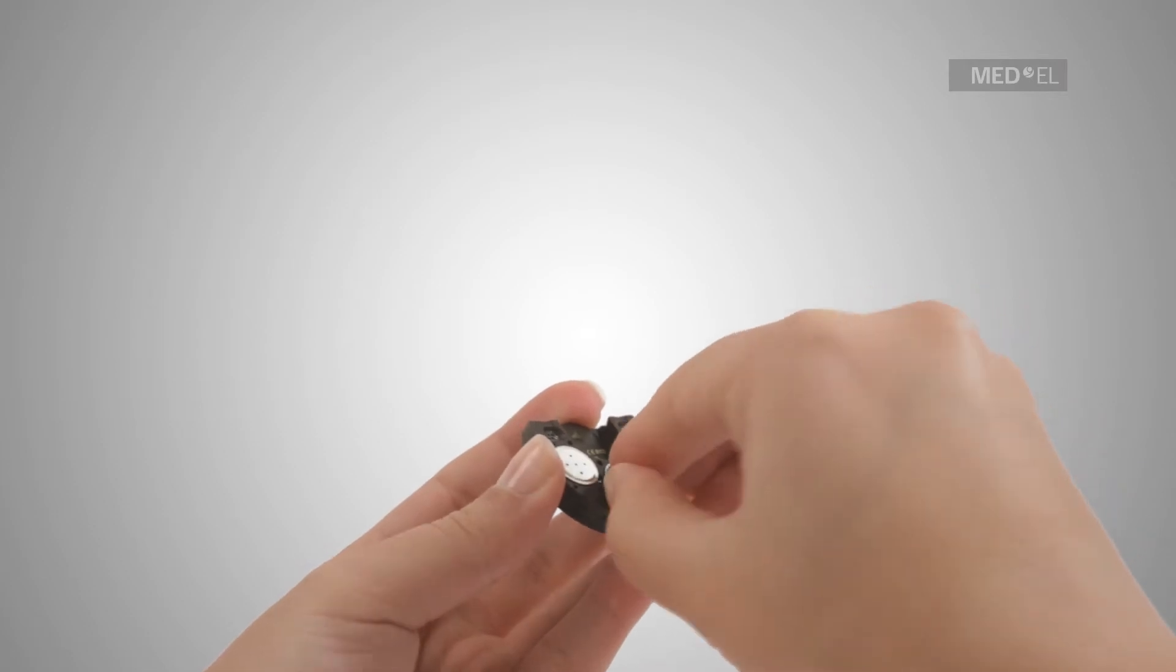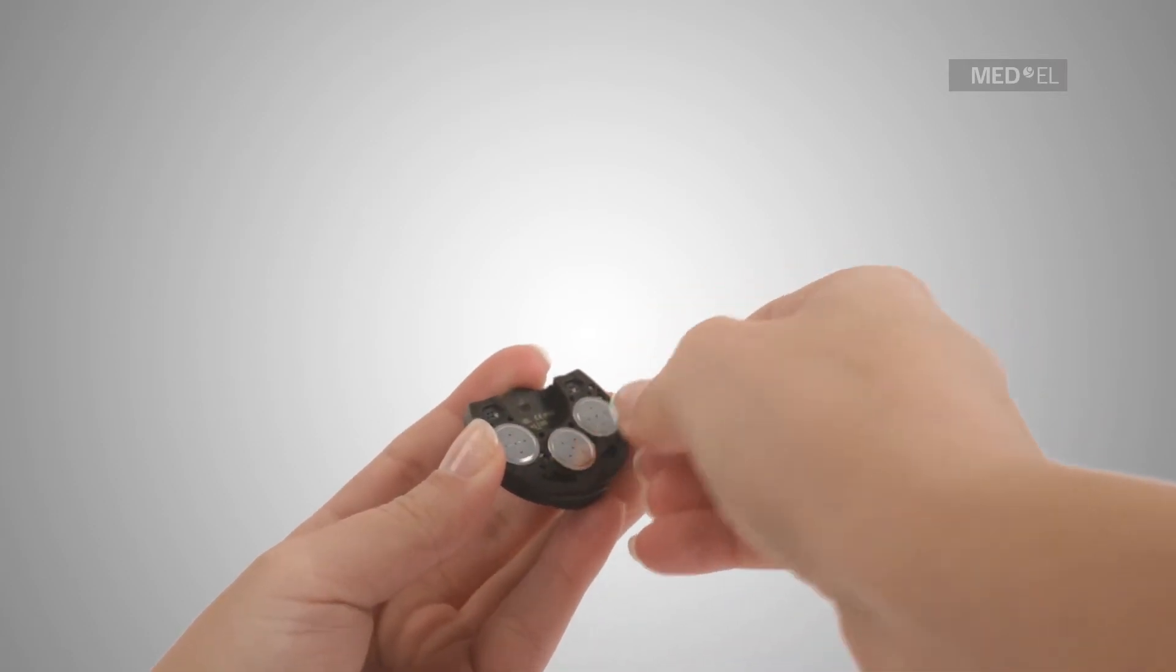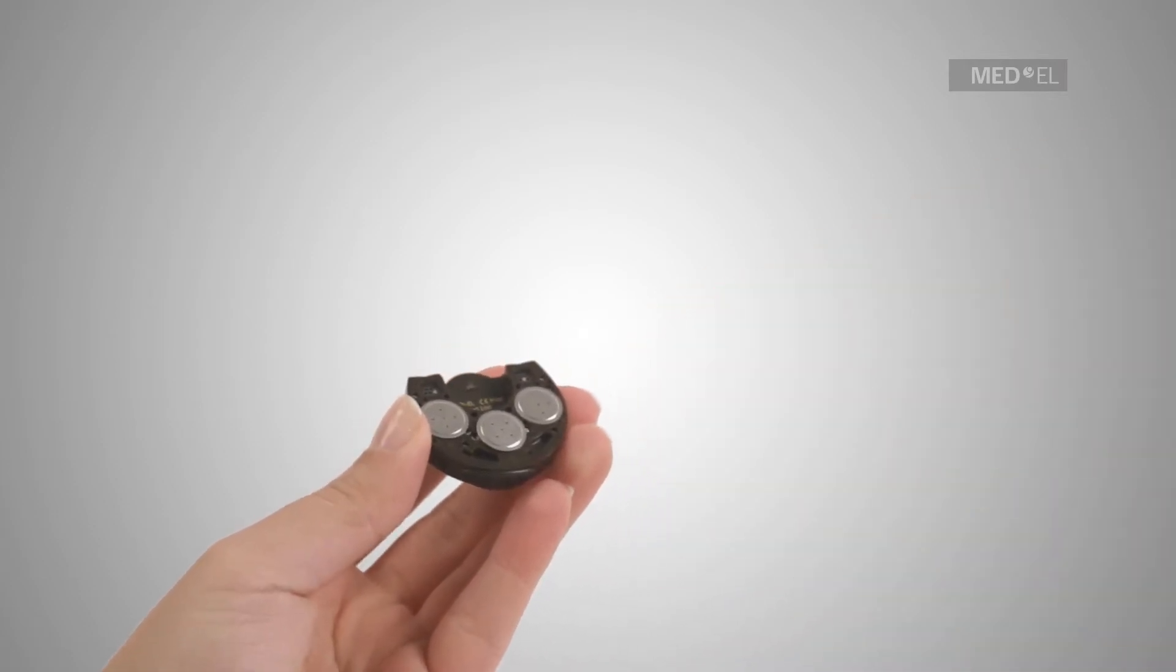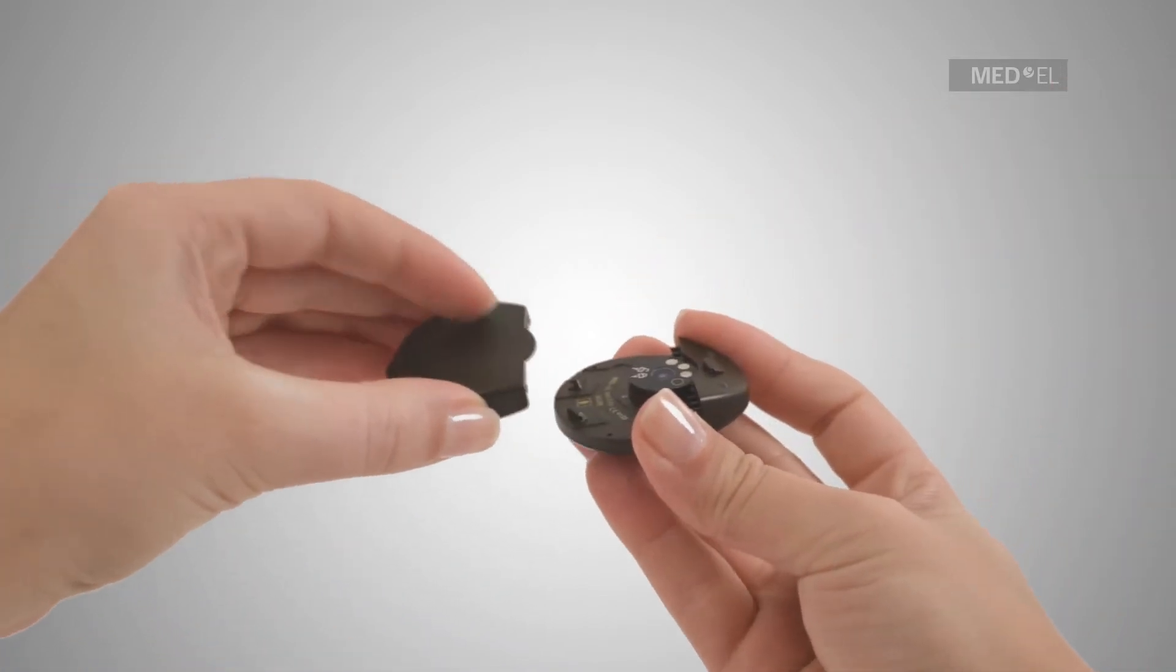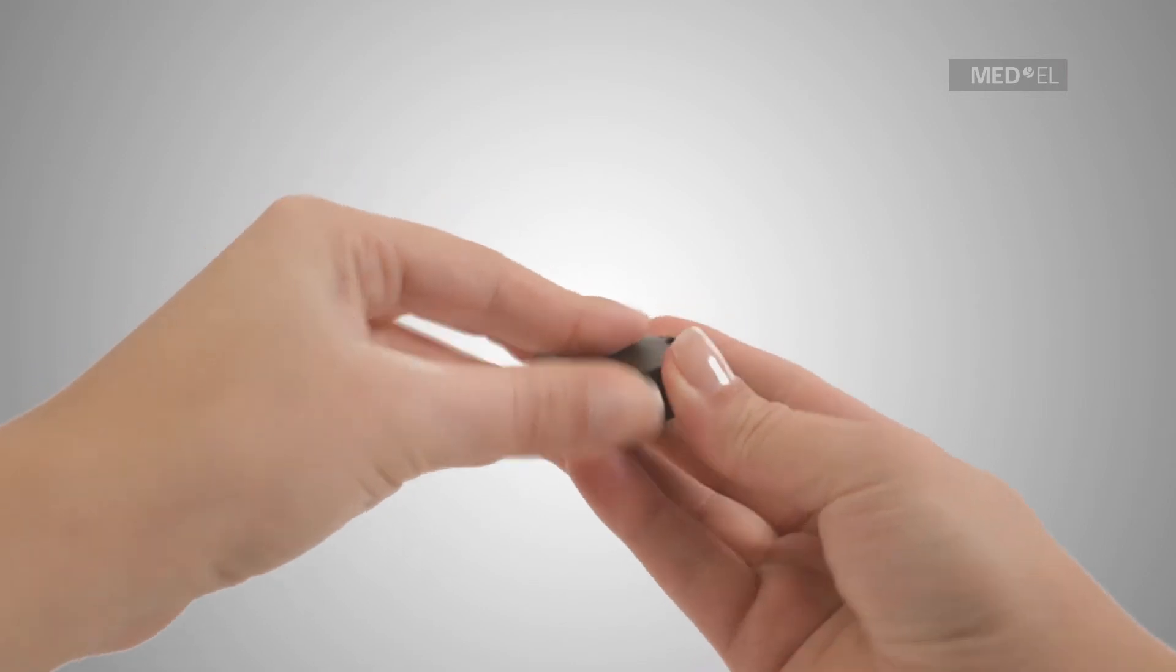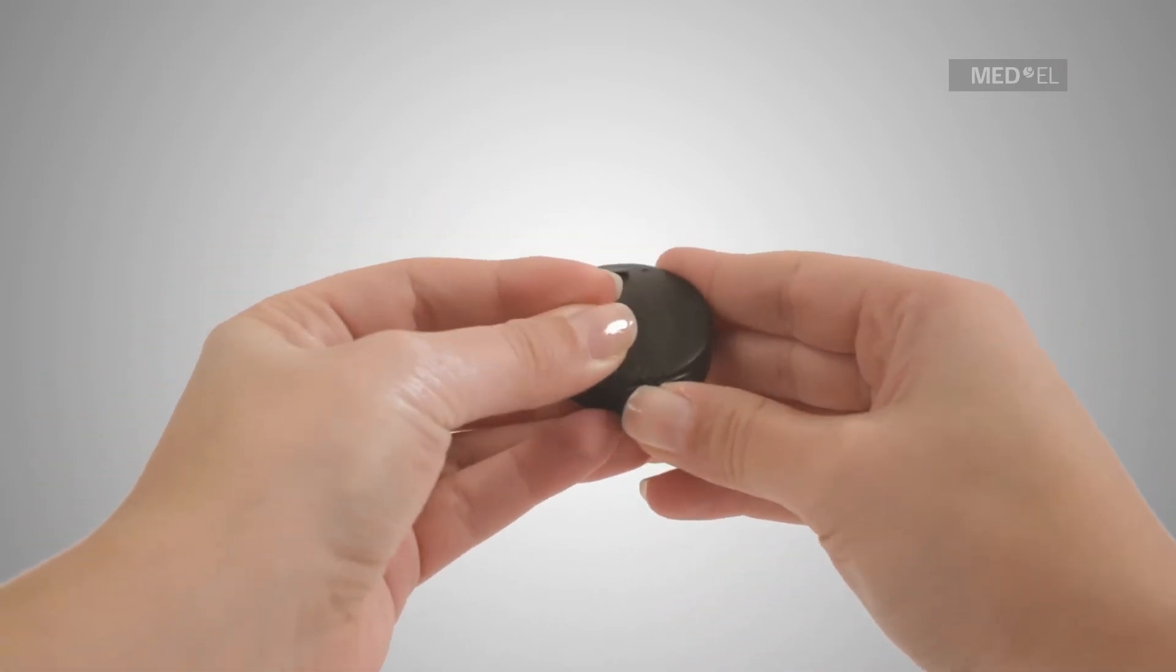To reattach the battery pack once the batteries have been changed, use the Gently Landing Airplane method. The battery pack should come in at a slight angle against the back side of the control unit.